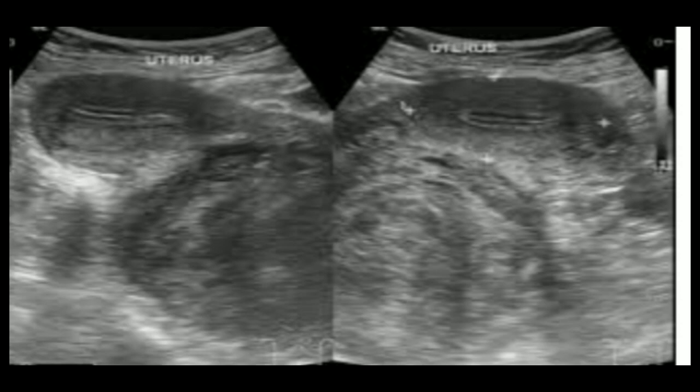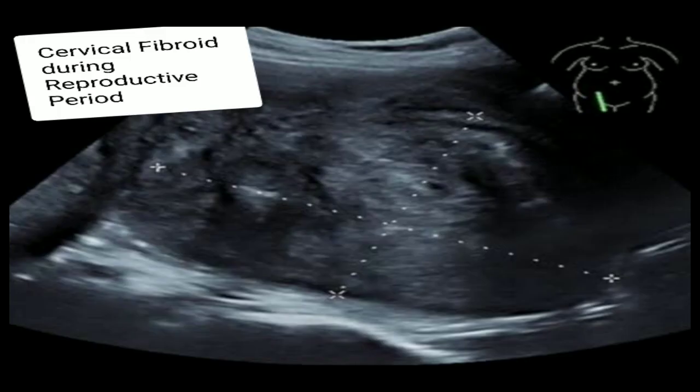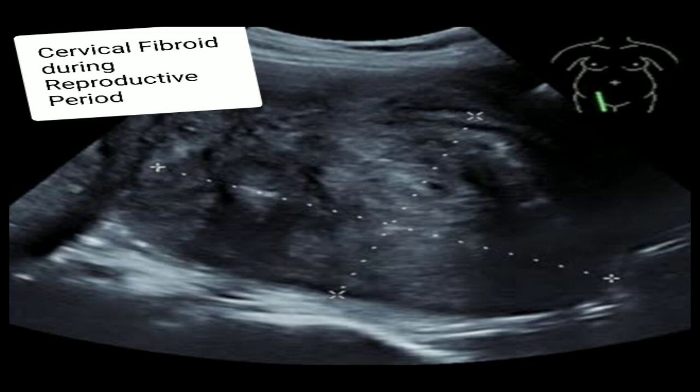Here you can see cervical fibroids during the reproductive period. We have discussed a few ultrasound appearances of the different types of uterine fibroids. Thank you so much for your patience. Allah Hafiz.